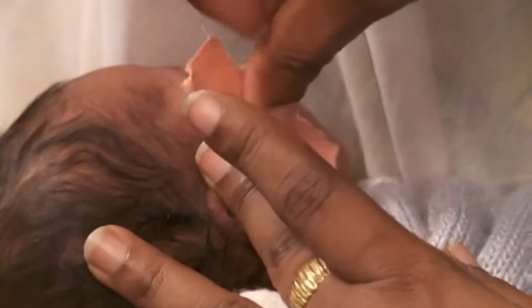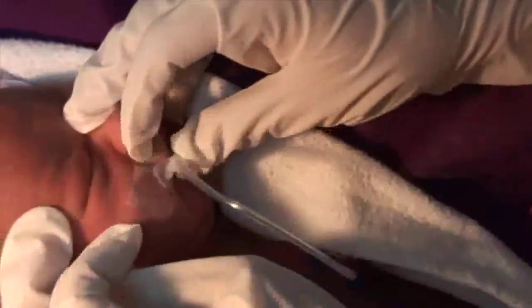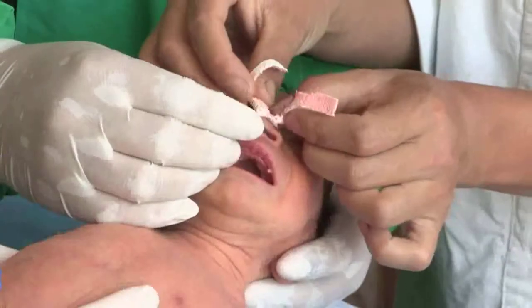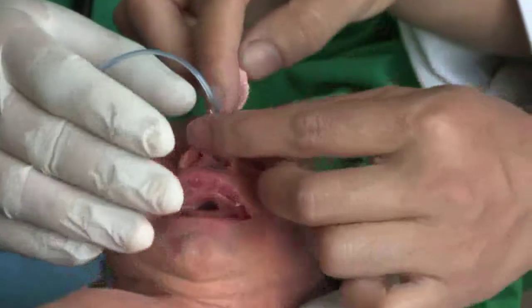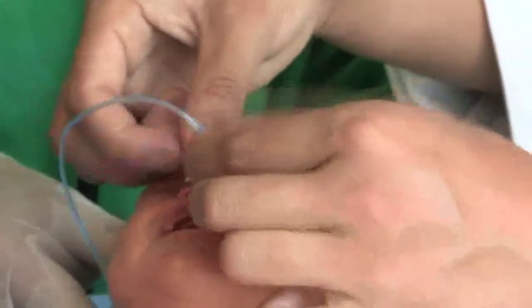When the tube is in the right place, tape it securely close to the nose or mouth to prevent it from sliding. Avoid pulling the tube tight against the nostril. Here is an alternate taping method. Note that the mark is left visible to easily check for placement before each feed.